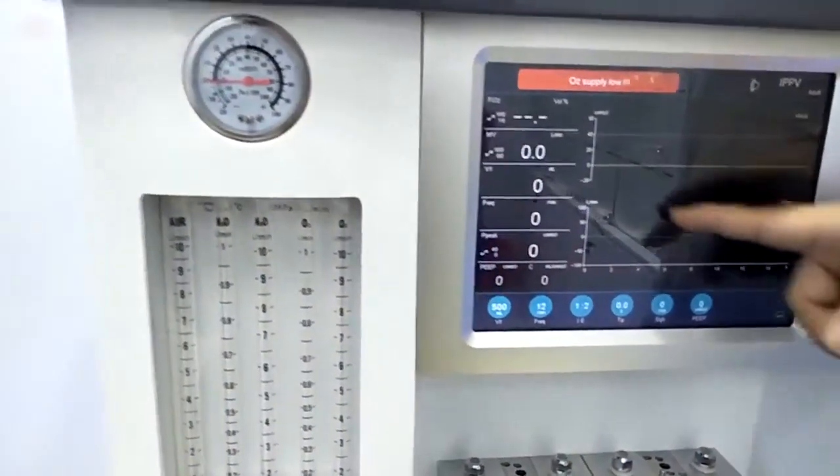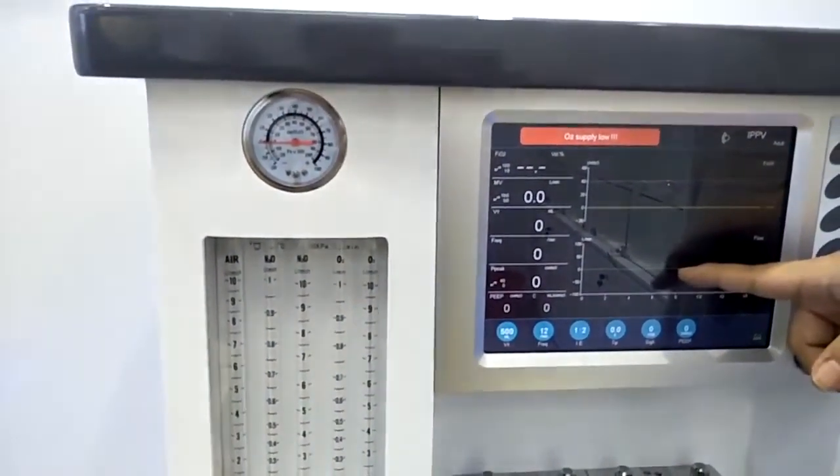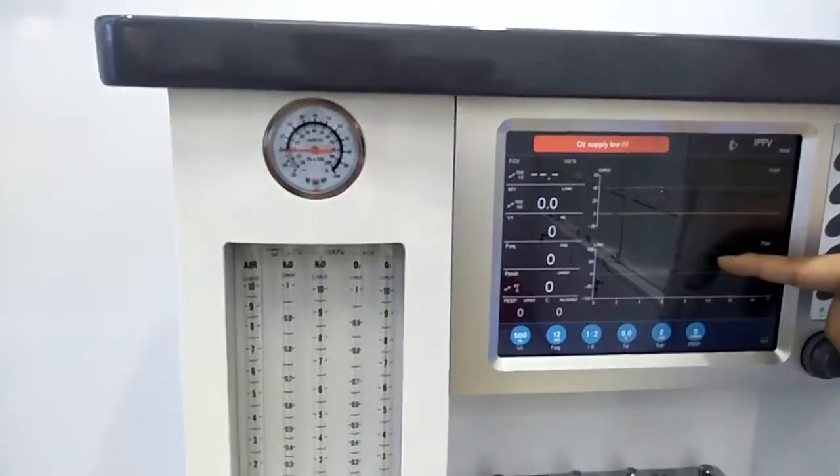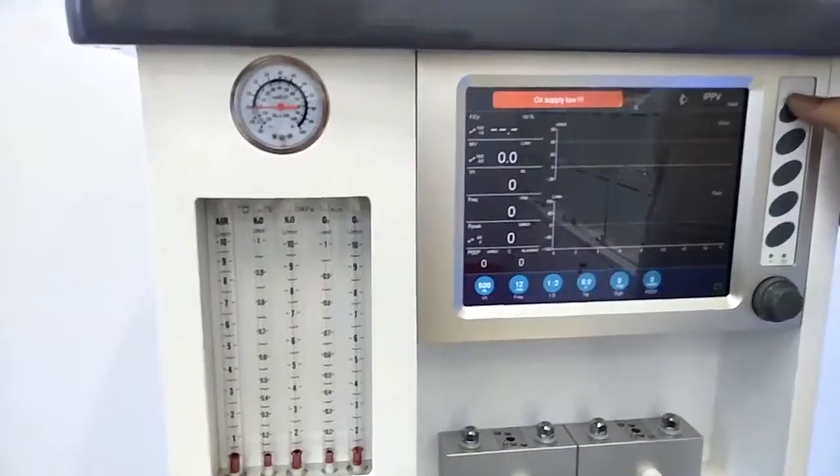Then the middle side here, for this machine we have a total of two waveforms shown on the screen synchronized. Usually it will be the PT and FT. Also, if you want to check the loop, we can change one of them to the loops. Then let's see the functions.